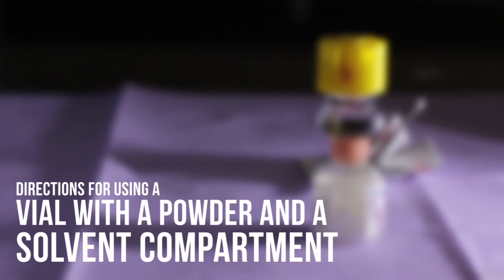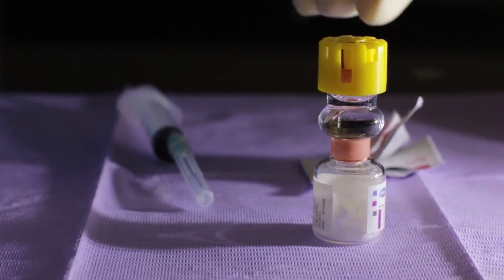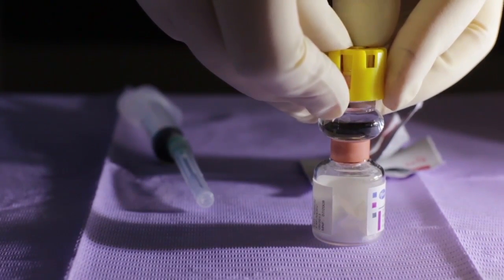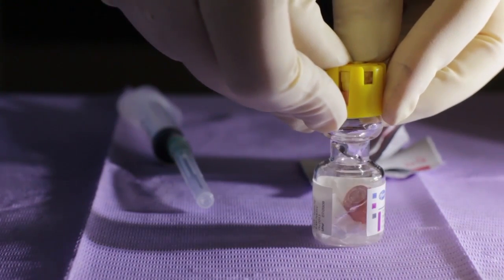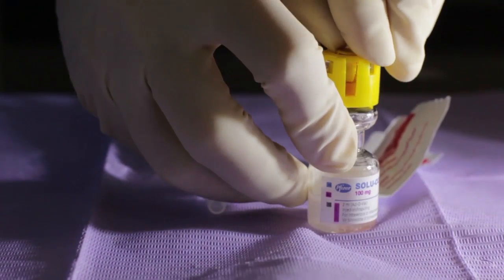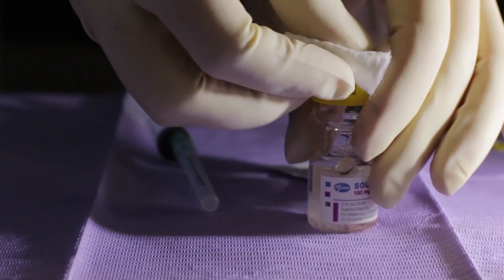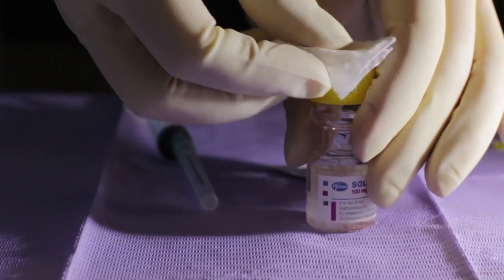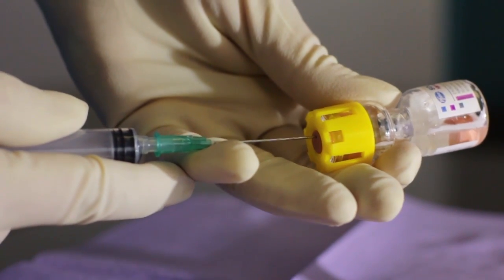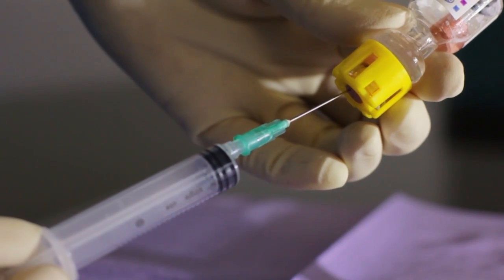Directions for using a vial with a powder and a solvent compartment. Note that this type of vial is not supplied in your kit. Press down on the plastic activator to force dilutant into the lower compartment. Gently agitate to effect solution. Remove the plastic tab covering the stopper. Sterilize the top of the stopper with an alcohol wipe. Insert the needle squarely through the center of the stopper until the tip is just visible. Invert the vial and withdraw the dose.